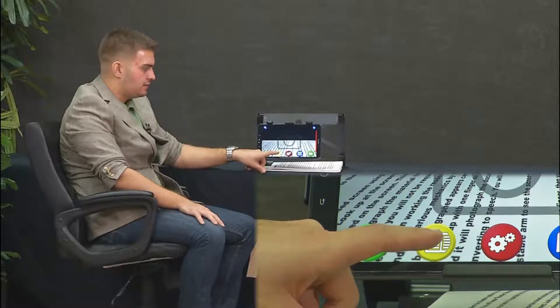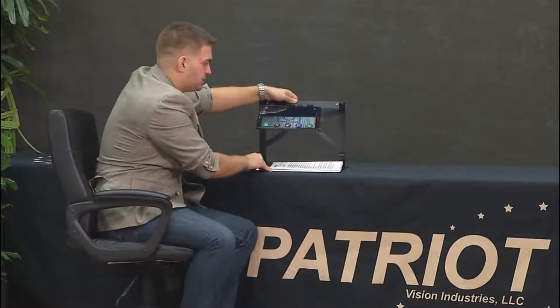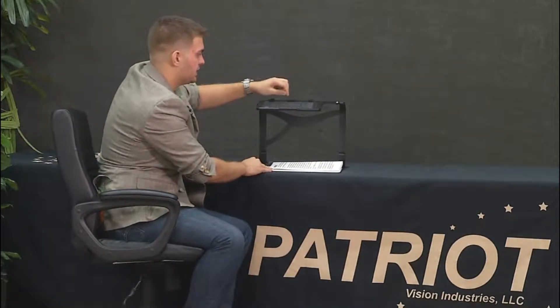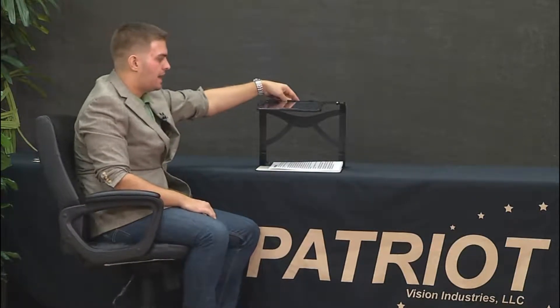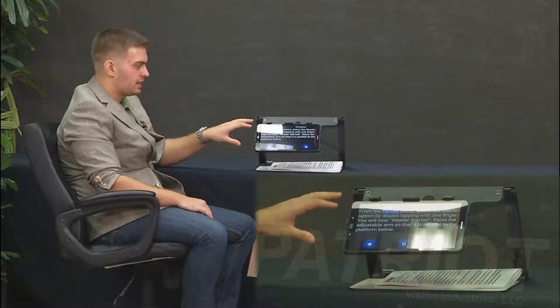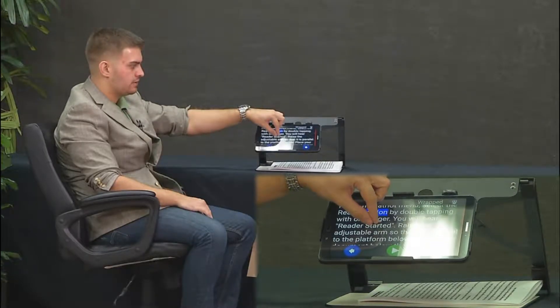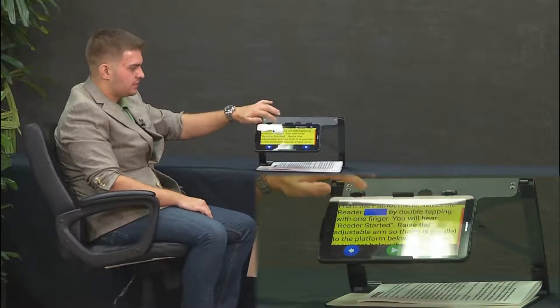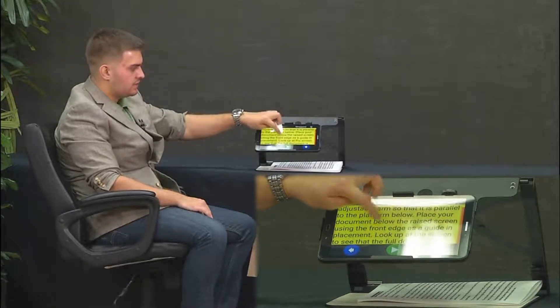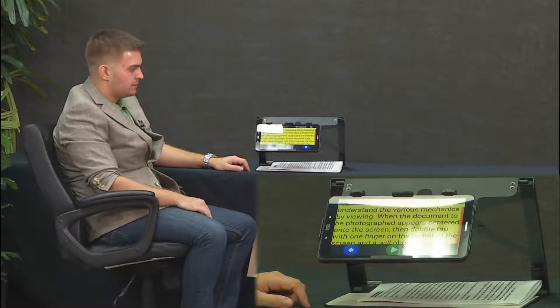In wrapped mode, when the device reads out loud, it's not a frozen image but more of a solid white on black or black and white color mode — kind of like a ticker tape. You can still pinch in or out to zoom with two fingers, tap with three fingers to change to different colors, and drag up or down with one finger to navigate the document.